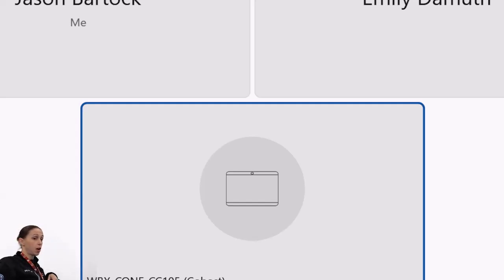So you're coming off inotropic and vasopressor support, very similar to when someone's on VA, looking at their heart under echo. It was actually pretty hard to tell in one of our patients who went on, he ultimately got transplanted for COVID. I'm thinking about the guy that was in 26. Yeah, you can start to wean flow. Because you're splitting, you can use clamps to return more to venous or more to arterial.